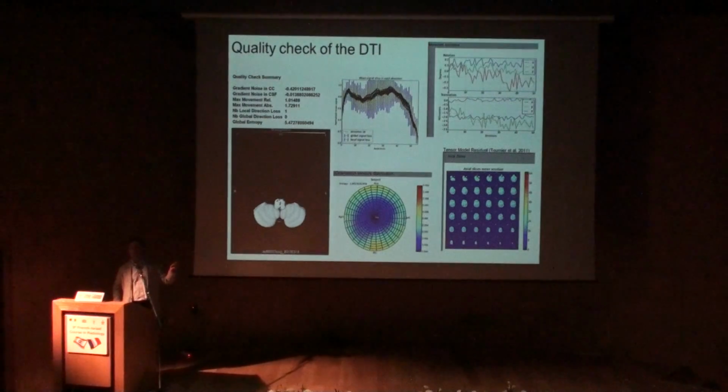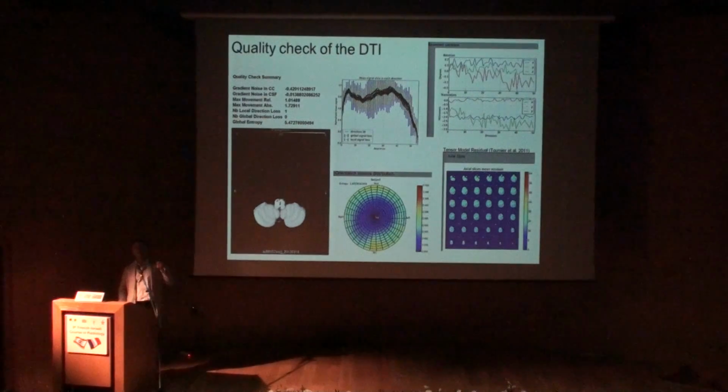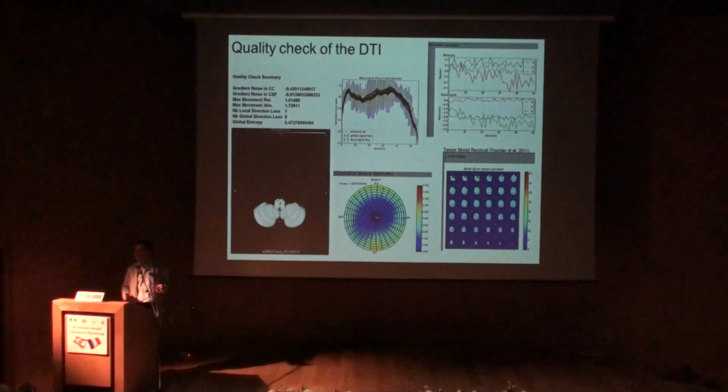So the first step is quality check, because even very small variation in the acquisition parameters will hugely change the values that you get in diffusion tensor. That's a major weakness of DTI: as Catherine showed you with motion, but it's also true with echo time, it's highly sensitive to variation in the sequence and poor quality of the sequence. So automatically it generates a quality check report, so you will get this line showing you motion according to slice number and direction.